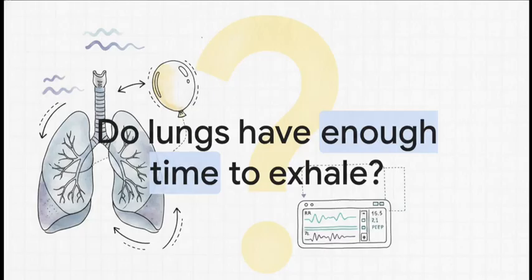Which leaves us with this final, vital question to ask yourself the very next time you're adjusting those complex settings on an ICU screen. Are you giving your patient's lungs enough time to completely exhale? By visualizing the balloon, understanding the volumes, the active flow, and the quiet pauses, you're no longer just reacting to random numbers on a monitor. You are actively protecting their lungs.